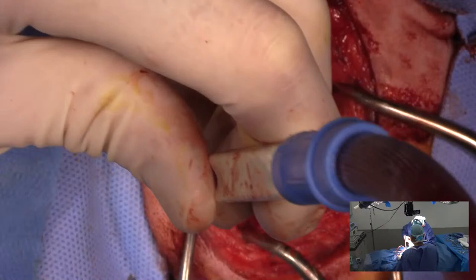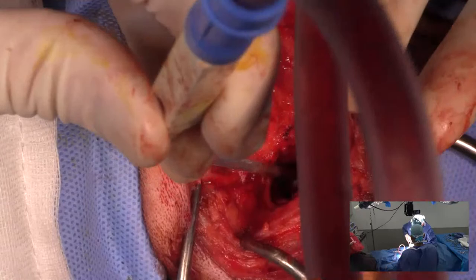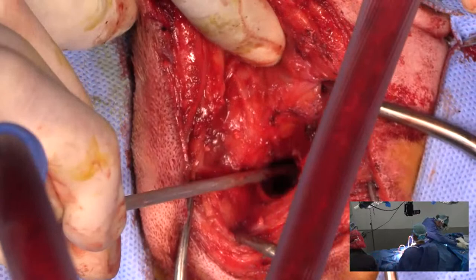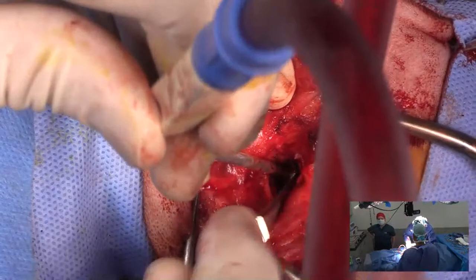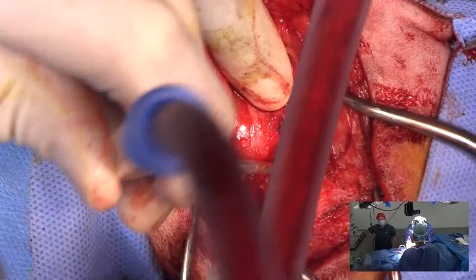There's a big chunk of secretory material there that I'm taking out. There's actually quite a bit down there. So I use a neuro kit when I'm operating on these because I've got a nice curette and picks and things like that. And so that's going to allow me the best opportunity to get a lot of this secretory crap out of here.